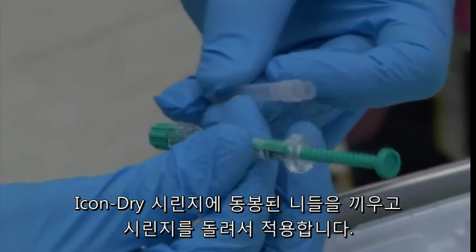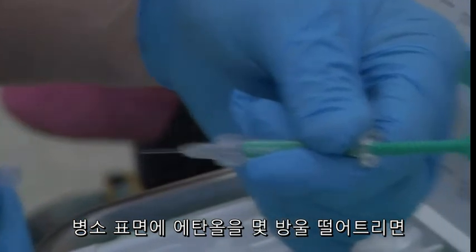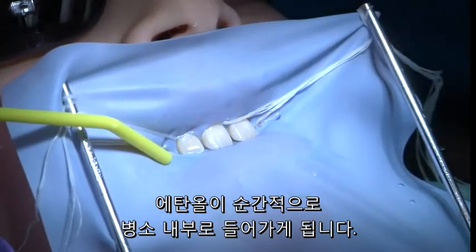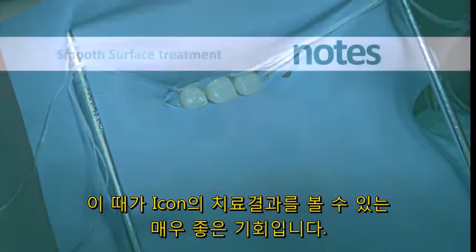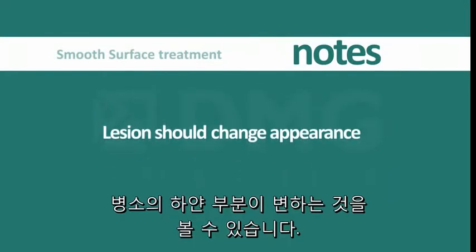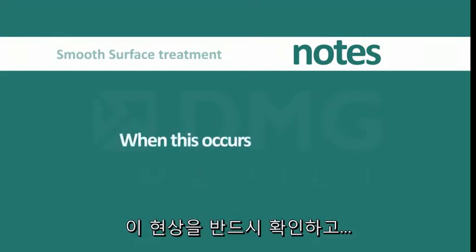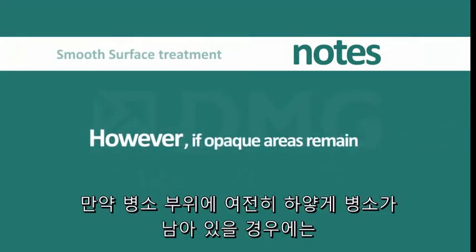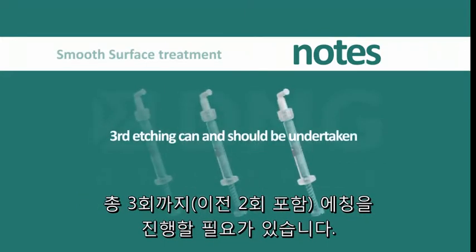This is accomplished by screwing the needle applicator onto the ICON Dry syringe and extruding a few drops of ethanol onto the lesion. While the ethanol solution is present within the lesion, there is an opportunity to preview how the lesion will appear after infiltration. During the first few seconds after application of the ethanol, there should be a change in the appearance of the lesion — the lesion should fade and produce a satisfactory aesthetic appearance. When this occurs, you may proceed with the subsequent infiltration steps. However, should any whitish or opaque areas remain within the margins of the lesion, a subsequent third etching step of two minutes can and should be undertaken.